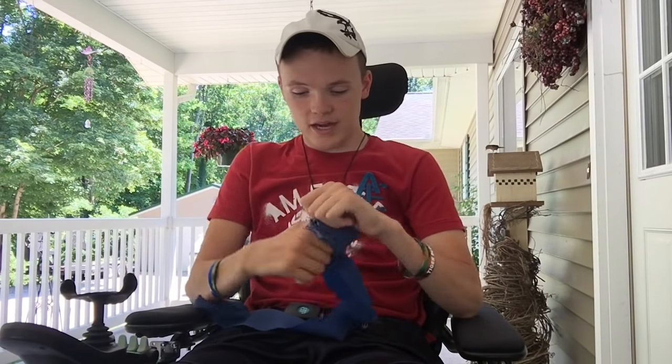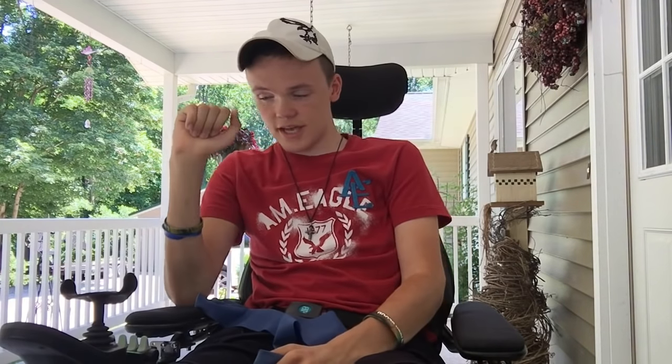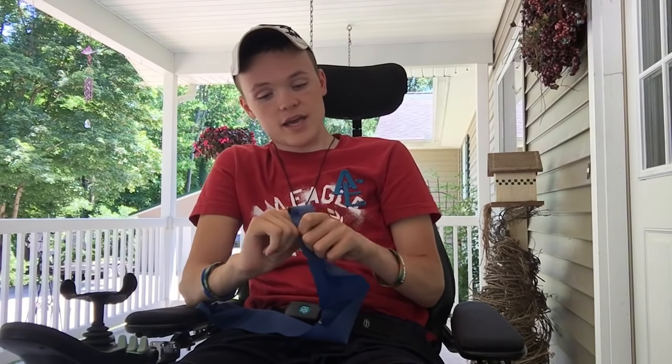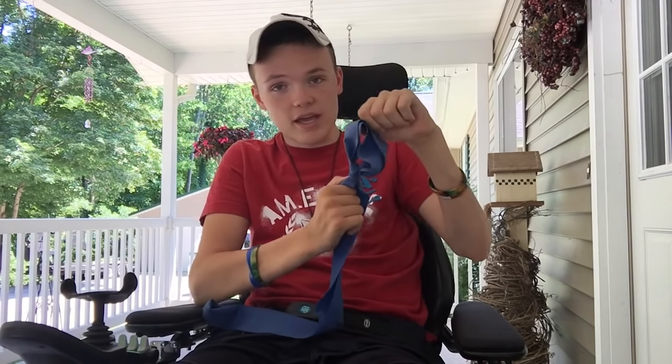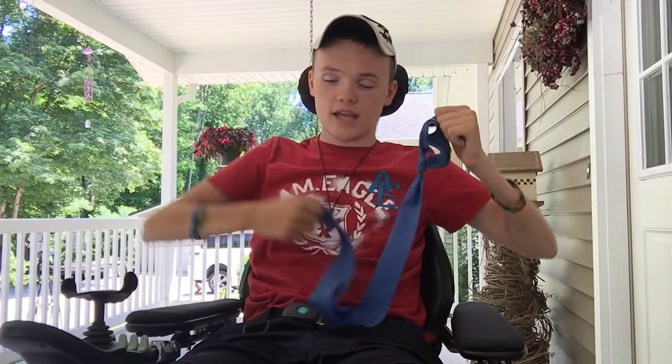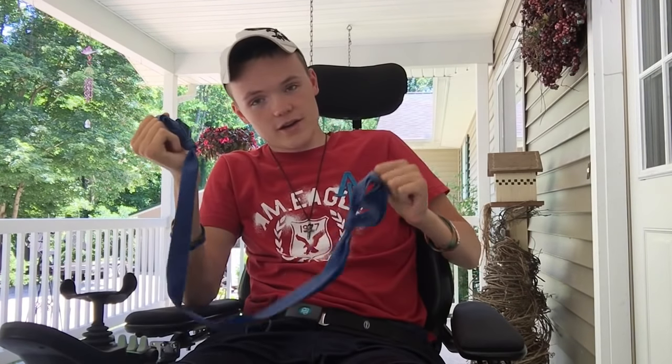And what I have done, since I'm a C5, 6, 7 complete quadriplegic, I don't have use of my fingers, I've actually tied a knot in both ends, making a hole or a loop like this, to where I can actually put my hands or fingers inside these loops.